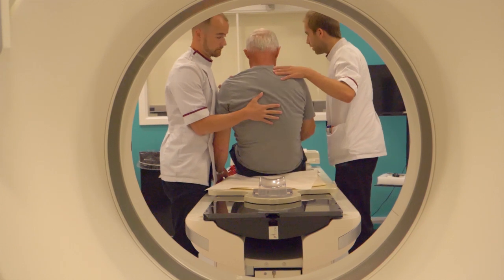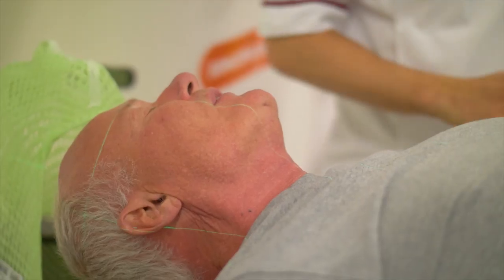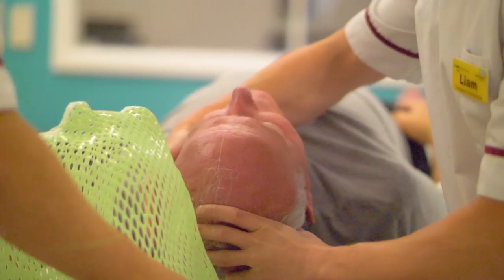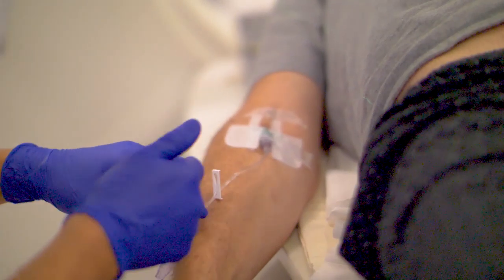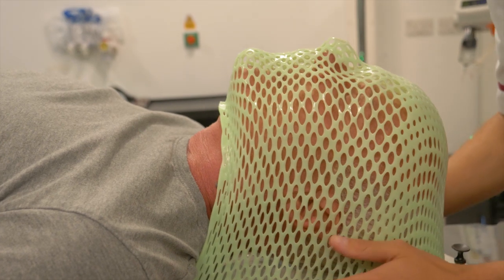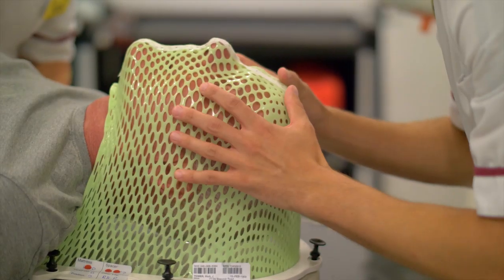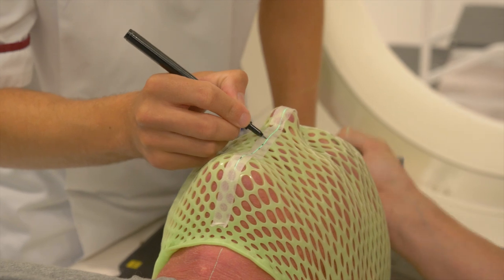The scanning team will get you into position on a couch, again with a neck rest, and get you into exactly the same position in which you had the mask fitted. A drip might be put into the patient's arm so that some contrast dye can be injected, and this may light up the tumour cells on the scan. The mask is placed directly over the face and fixed onto the couch of the scanner so that the head and neck can't move. A few small adjustments may be made, and then a few ink marks might be made on the mask so that the same position can be achieved every single time.